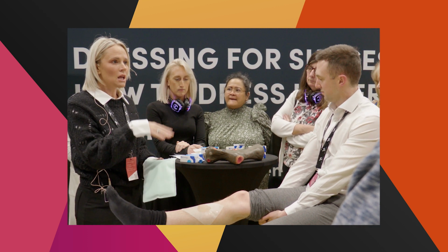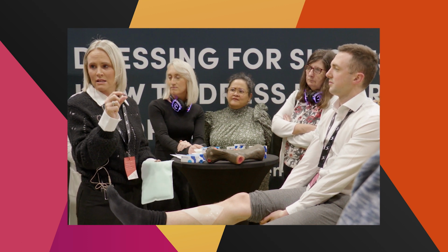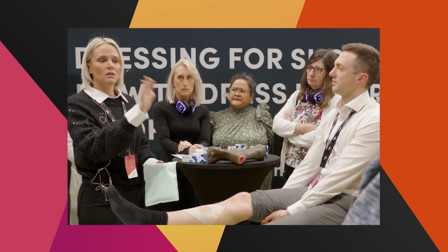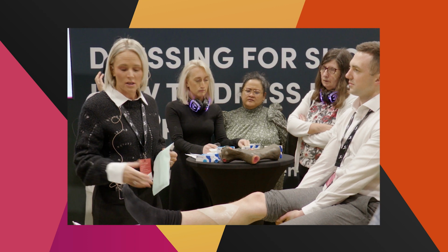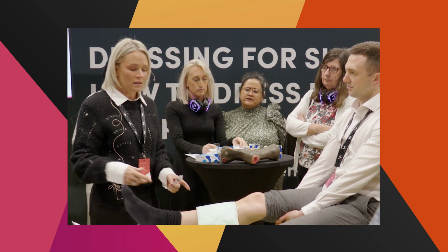So if it's low exudate, say you've taken some staples out and there's just a small area that hasn't knitted together, then I may just put a bit of Flaminol Hydro and just a post-op surgical dressing. The higher the exudate, that's when I'm going to be using the secondary dressings to manage it. So then I'd just pop your secondary dressing on and then bandage his leg up.